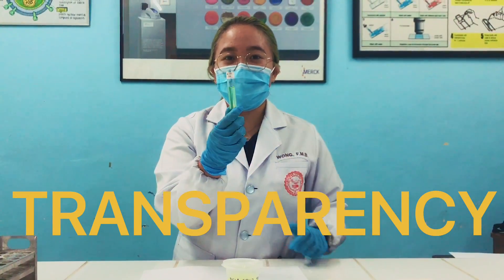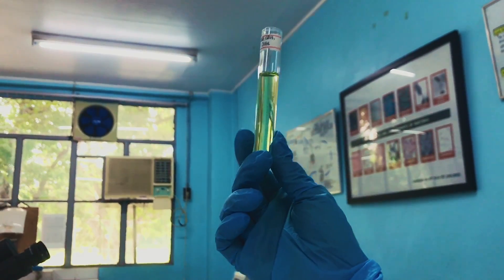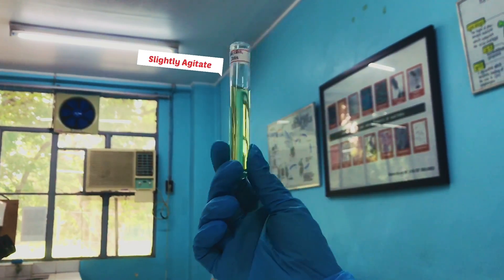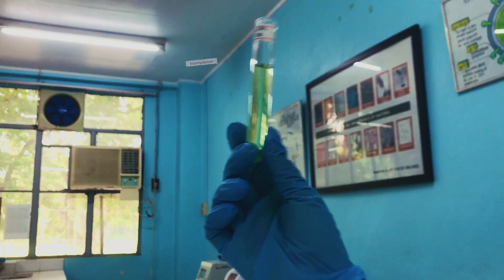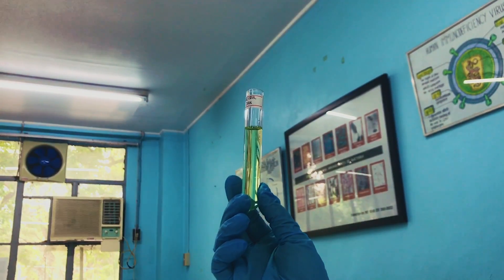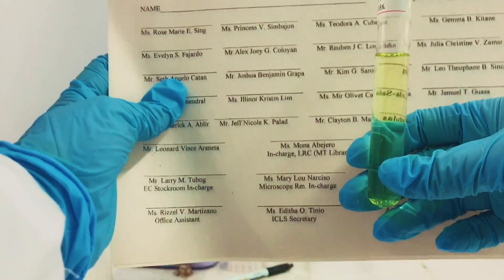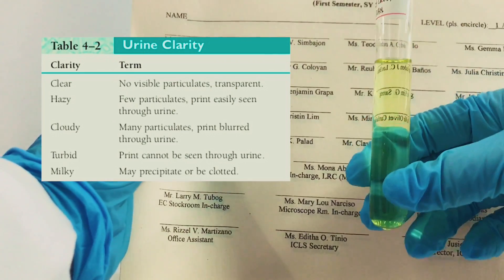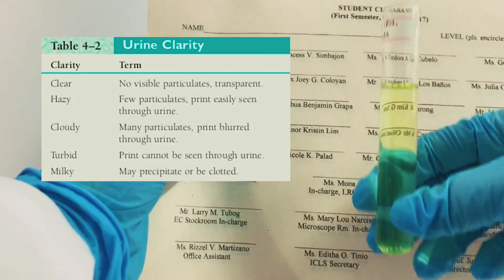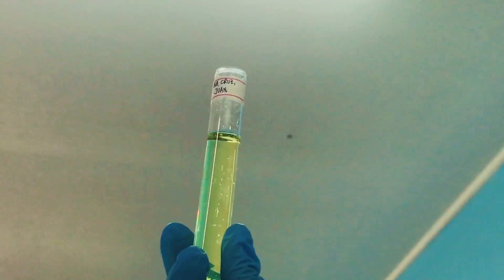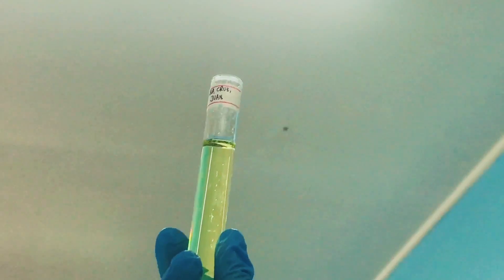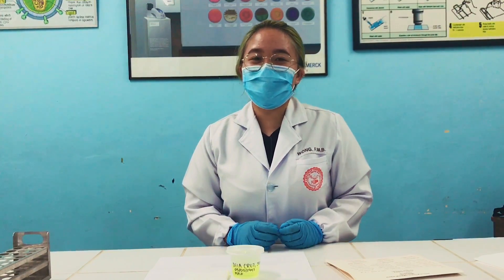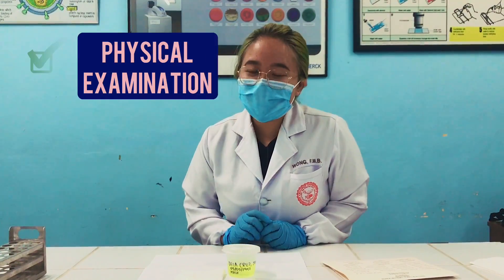Next, we'll determine its transparency or clarity. To do that, hold the test tube at the bottom part and slightly agitate it to know whether there are particulates floating. If there are none, report it as clear. If there are, get a printed material and hold it against the tube to determine the level of transparency. For this urine, its transparency is clear. That concludes the first part of your analysis, which is the physical examination.